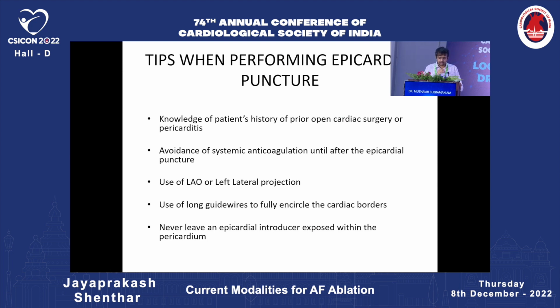This is all far easier in a patient with a normal pericardium and who hasn't undergone previous cardiac surgery. I think other people will also agree that this becomes almost a no-go in patients who have already had prior cardiac surgery and patients who have adhesions. Everyone has their slightly different method of how they do systemic anticoagulation. Preferably, take your access before you systemically anticoagulate the patient. If you've already done an endocardial ablation, you're not happy, and the patient is on full heparin, you can reverse the heparin and then take the epicardial access.